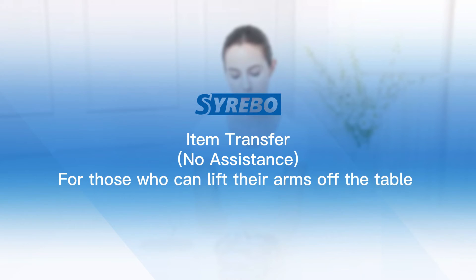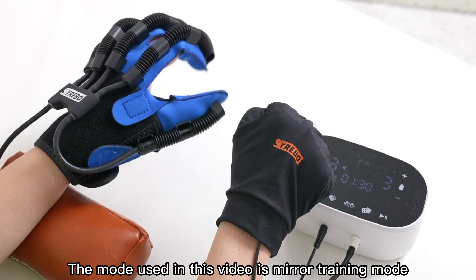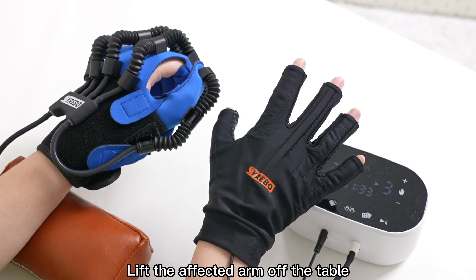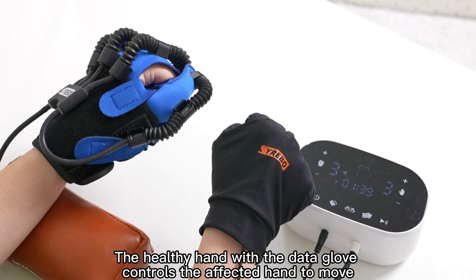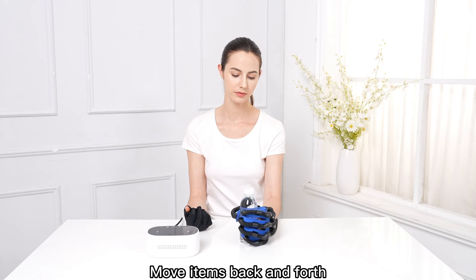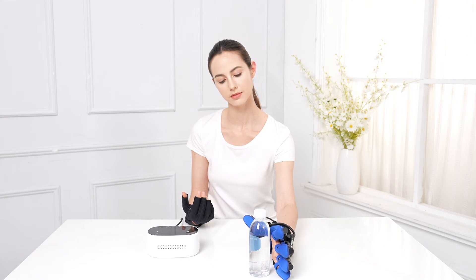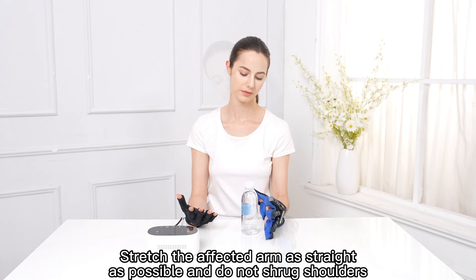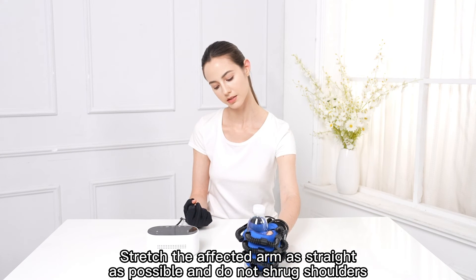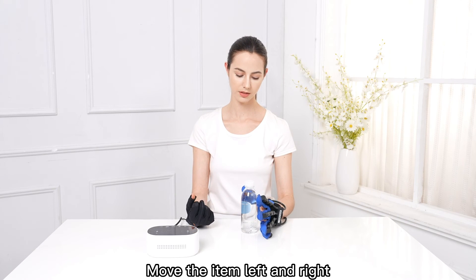Item Transfer — No Assistance. For those who can lift their arms off the table. Choose the passive training or mirror training mode; the mode used in this video is mirror training mode. Lift the affected arm off the table. The healthy hand with the data glove controls the affected hand to move. Move the item left and right, and back and forth. Stretch the affected arm as straight as possible and do not shrug shoulders. Move the item left and right.